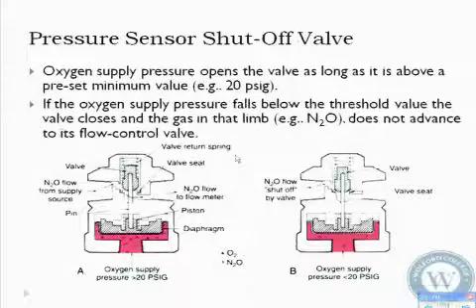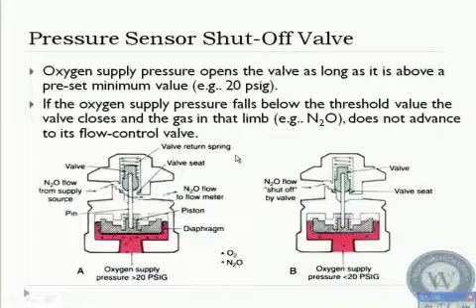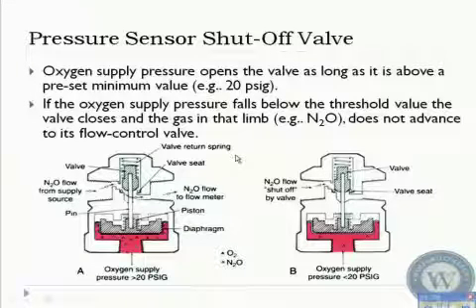This is the valve itself. I'm not going to ask questions about it. I'm not going to put a picture of this on here. You don't have to know what the components are. We can't even see this. I mean, it's inside the machine. We can't even take the machine apart.